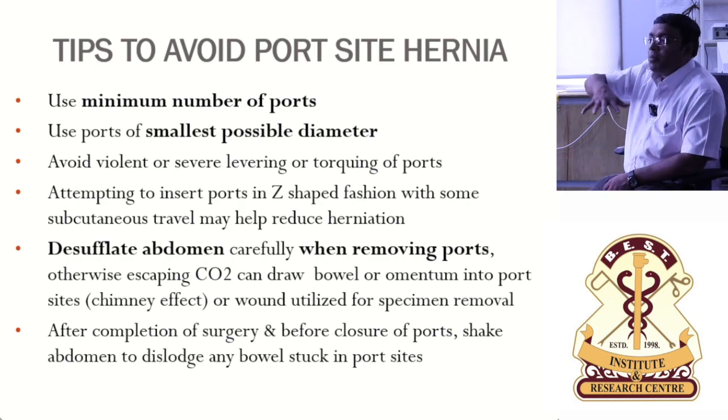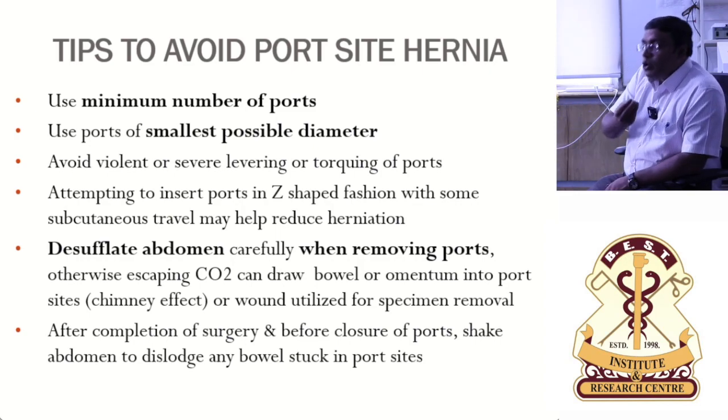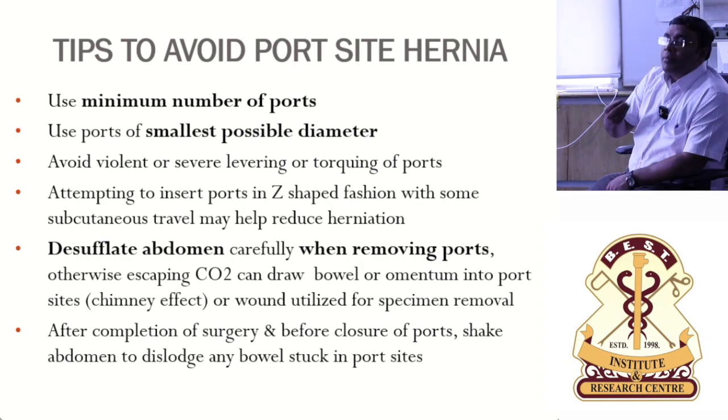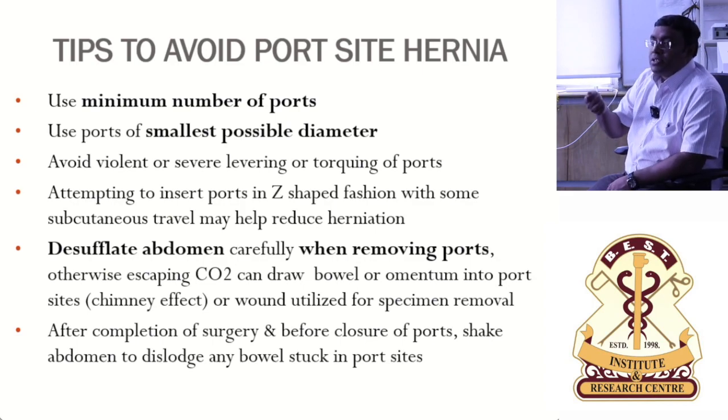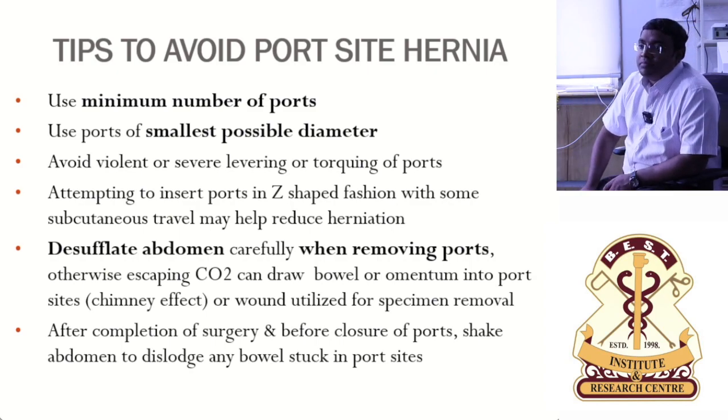Never press the abdominal wall so that gas comes out. When you press that, the bowel loops and omentum can come out, and if you are closing the ports by the direct method, you may take a bite of the bowel loop also. These things have happened.